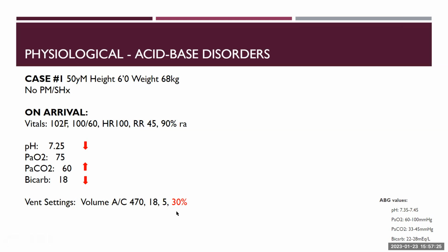So a big point, highlighted in red, that Nancy, who started the crit care modules, really wanted to highlight is that you don't want the patient to have so much oxygen that it leads to radicals floating in their blood. So even though you might start the FiO2 at 100, get to a point where you can lower it so the patient is comfortable, but not overburdened with way too much pure oxygen.